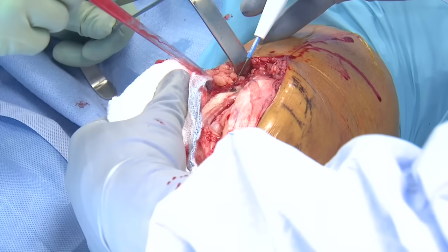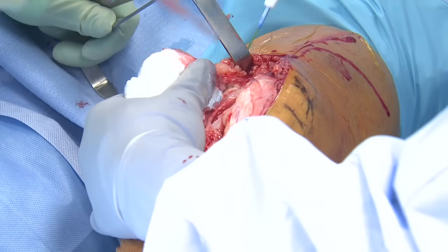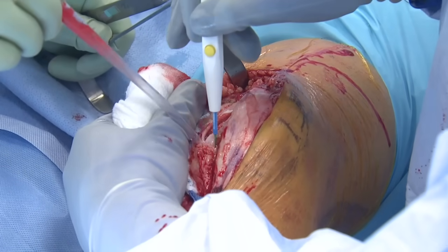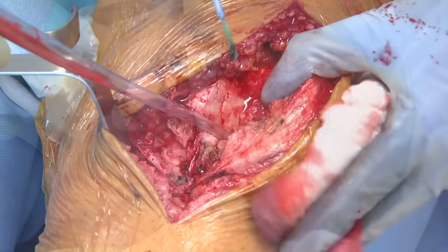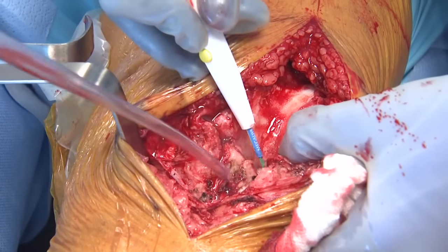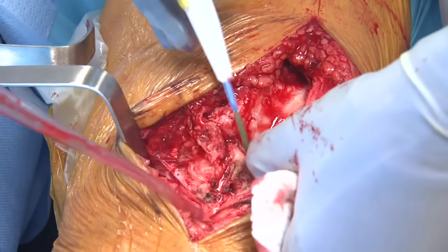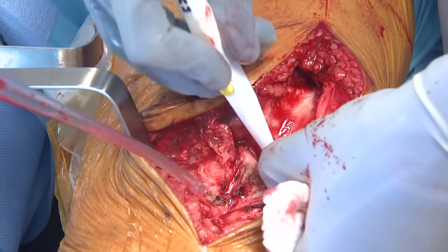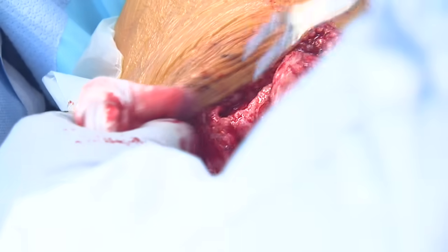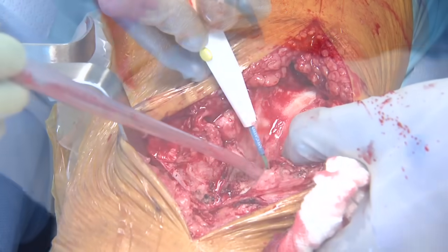Deep tissues are incised directly with sharp dissection. Cautery is utilized to allow any hemostasis. Medial and lateral proximal tibial releases are performed to allow appropriate mobilization of tissue and visualization of the bony tissues. Retractors are placed to aid in such.